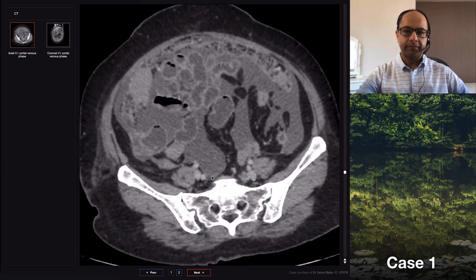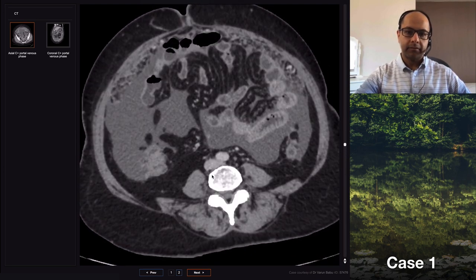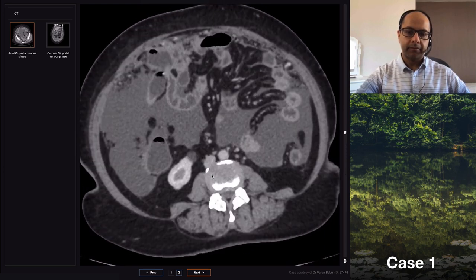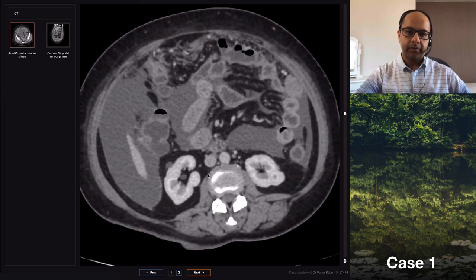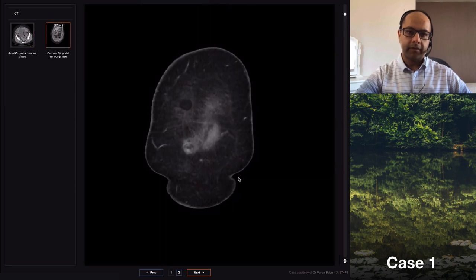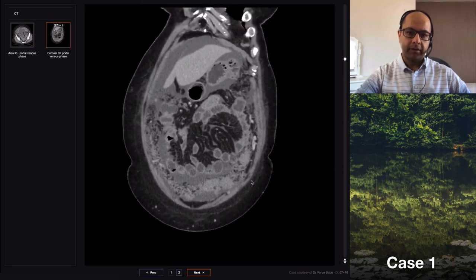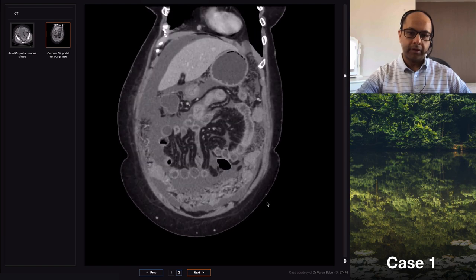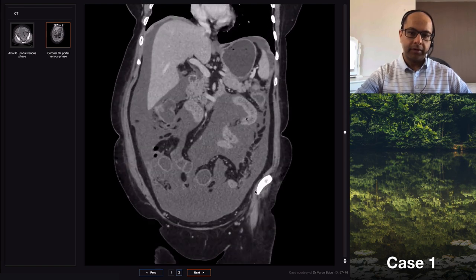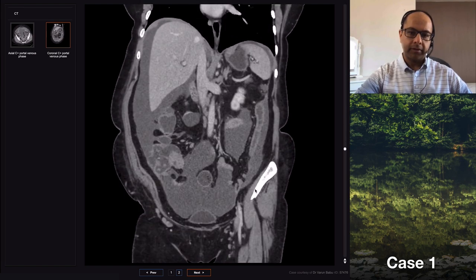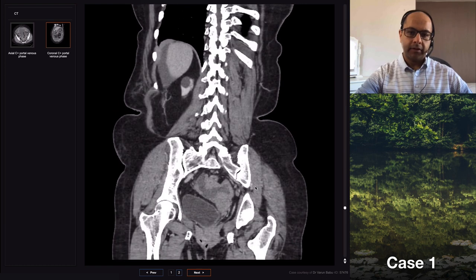The borders are not that well defined. I can't see the left adnexa clearly, but the right adnexa is abnormal. In summary, there's gross ascites, omental thickening and caking.